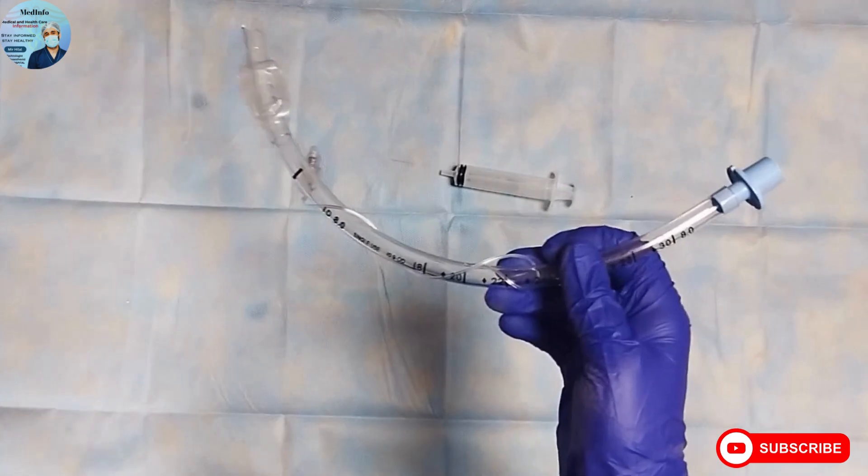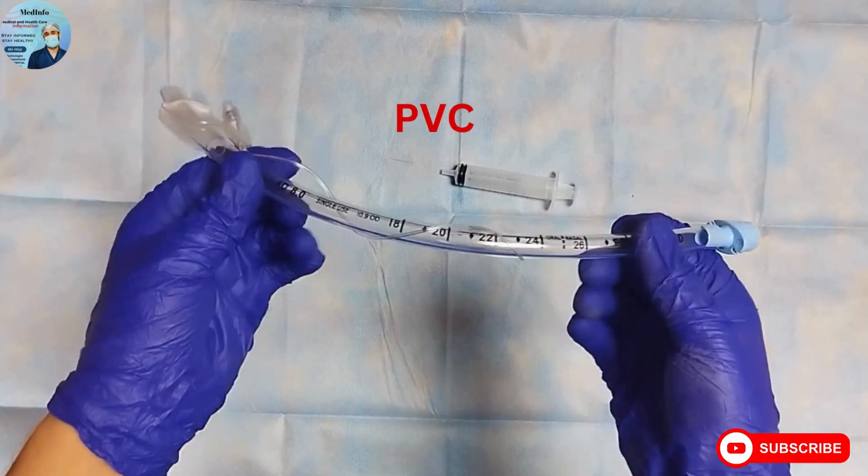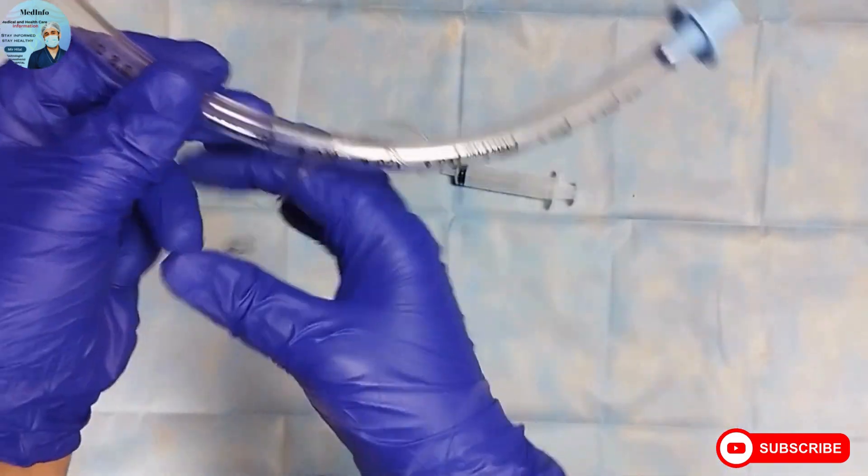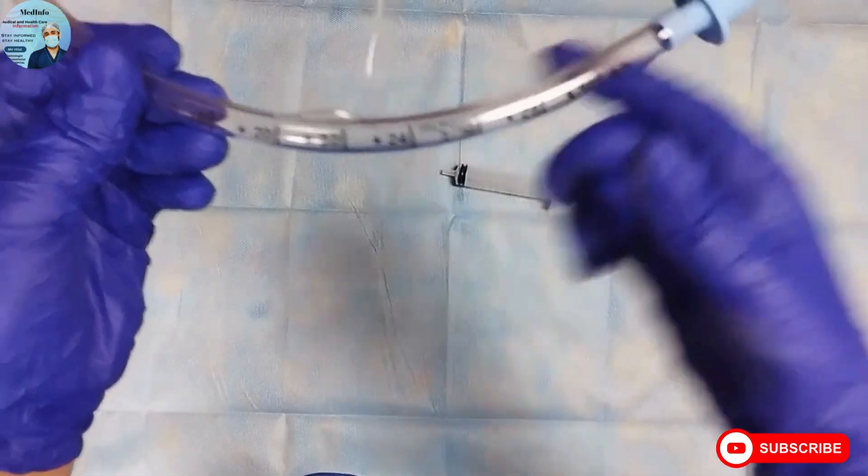Endotracheal tubes are mainly made of polyvinyl chloride and may be cuffed or uncuffed. These modern day endotracheal tubes are disposable and transparent.